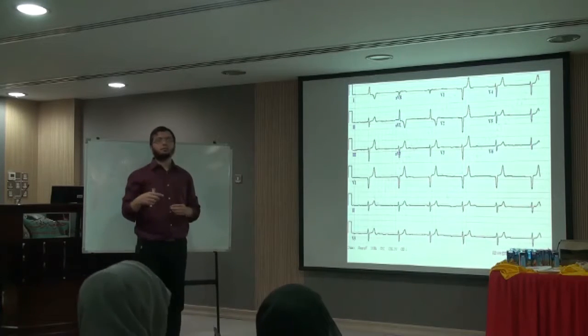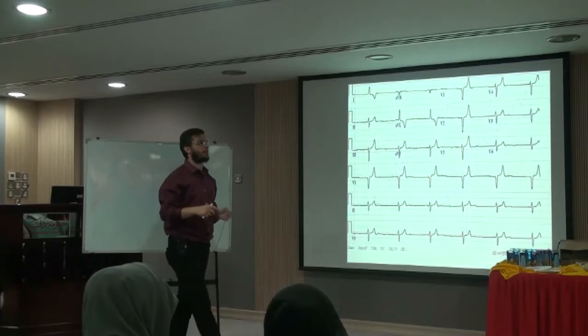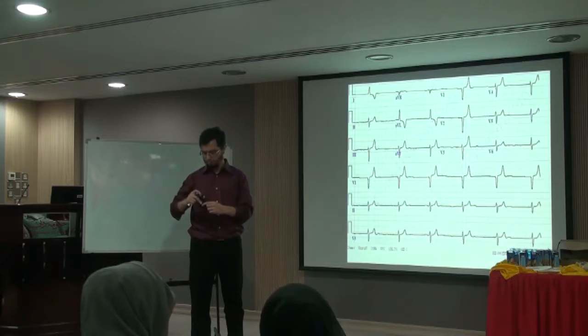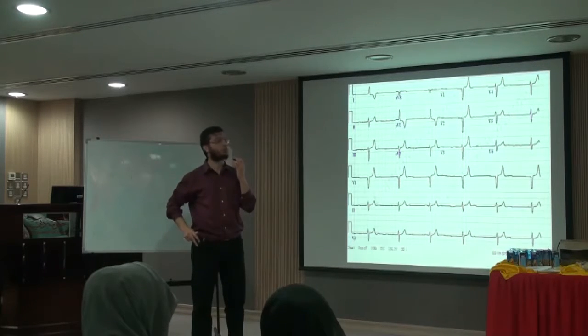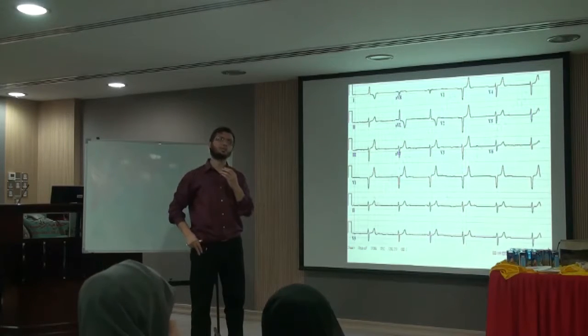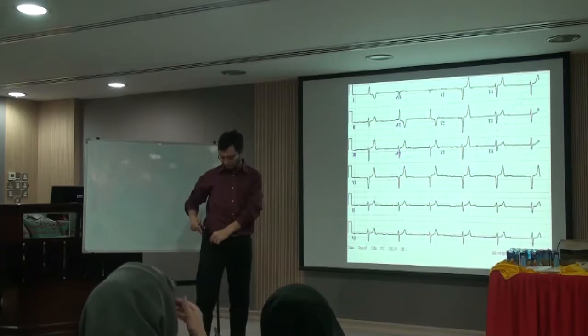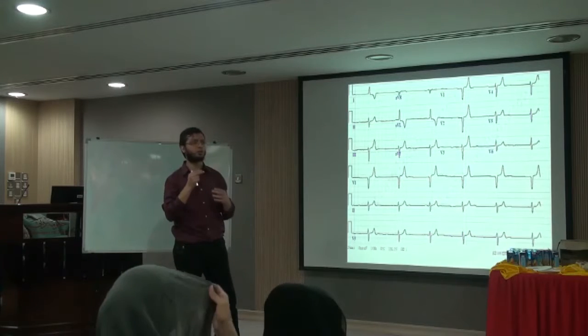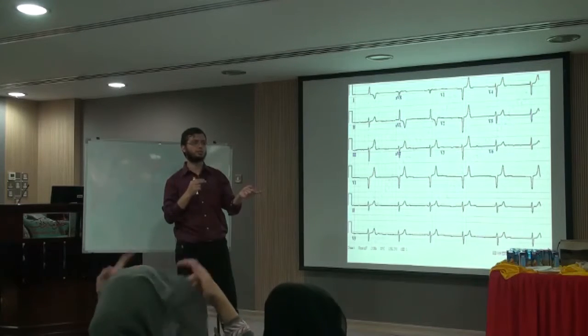Maybe because I mentioned the word discordant, we have concordant and discordant. If things are going in the same direction, we call it concordant.